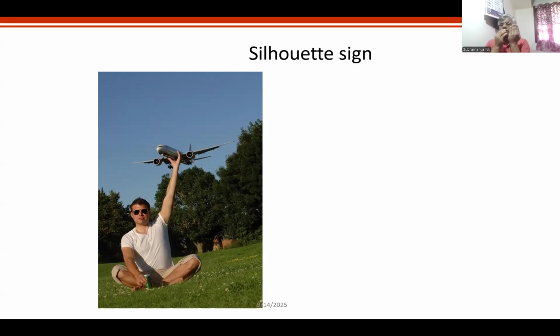You look at my hands. This is my right hand and left hand. Are my right hand and left hand in the same plane, right? Yes or no? Same plane? Yes, correct. My right hand and left hand are in the same plane. Now I'll give you a picture. Are my right hand and left hand in the same plane, although they are overlapping? They're not. Did you understand? I'll just show you one minute. I'll just show you now my right hand and left hand. The picture in X-ray is overlapping, but they are in different planes. That means my right hand ulnar border is seen.